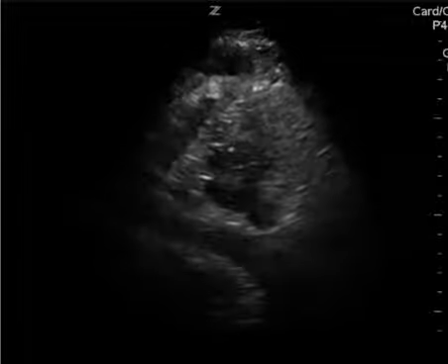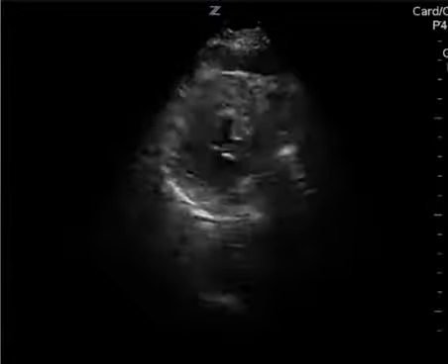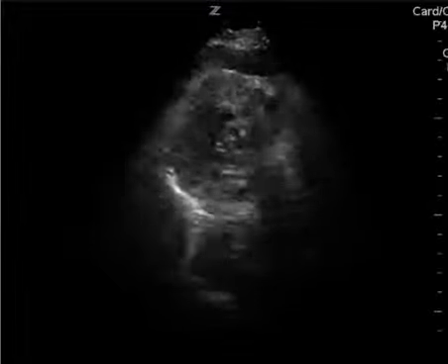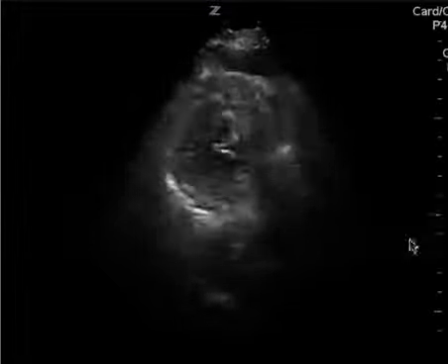It's hard to tell based on this one view. This is saved here, and though it looks really fast, it is not VTAC or V-fib. It's just that this is a one-second clip, and when it reviews, it looks really fast.